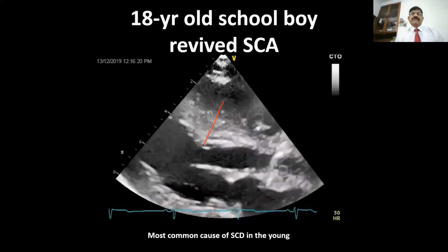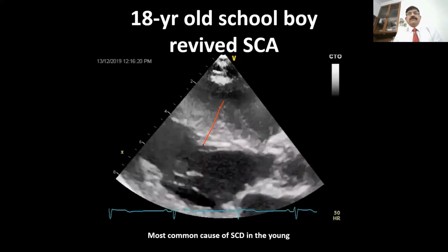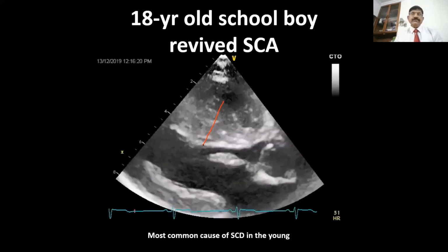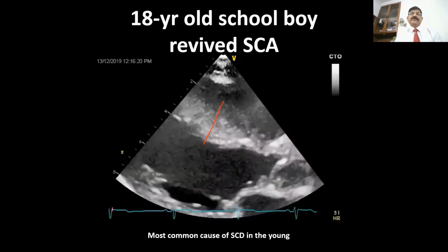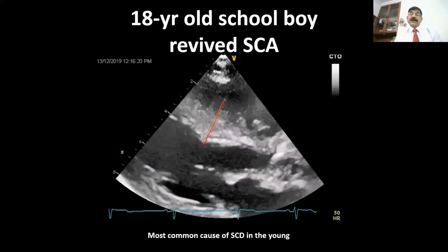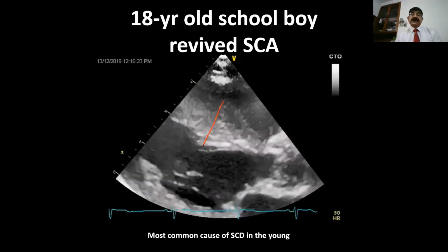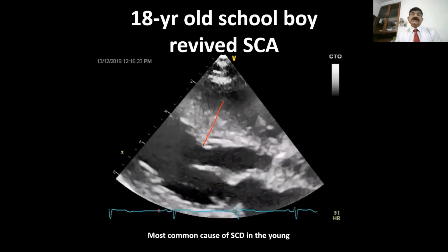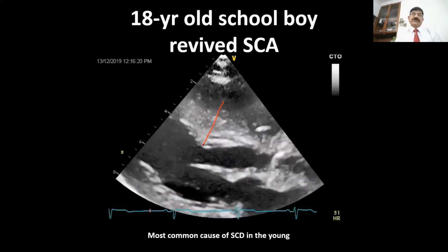So you know, of course, that this patient has what we would call hypertrophic cardiomyopathy. The characteristics here are asymmetric septal hypertrophy. The septum is at least 3 times the thickness of the posterior wall. You also see the convexity of the septum towards the left ventricular cavity.